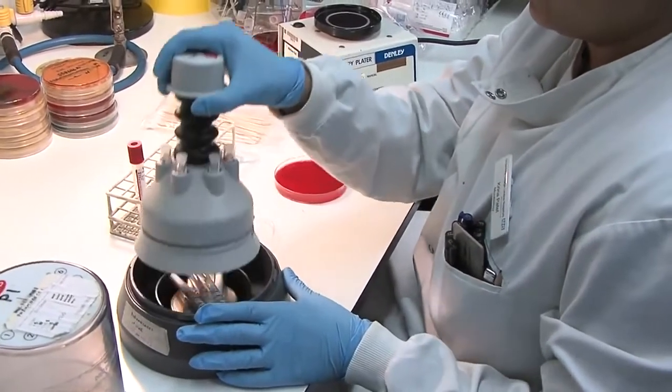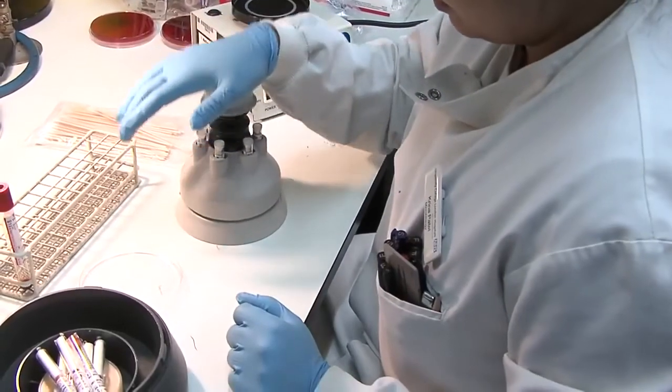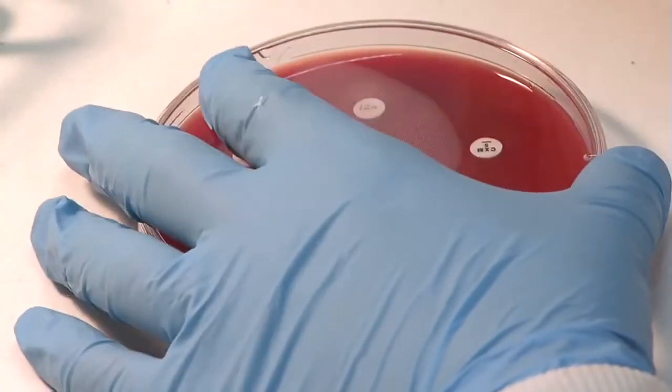Filter paper discs that contain specific antibiotics are applied to the sensitivity plate using a disc dispenser, and during incubation the organism will grow, and at the same time the antibiotics will diffuse out of the discs, and sensitive bacteria will be inhibited by the antibiotic and not grow around the discs, while resistant bacteria will not be affected by the antibiotic and grow up to the disc. Thus, the culture and sensitivity plates are incubated for between 18 and 24 hours and then examined.